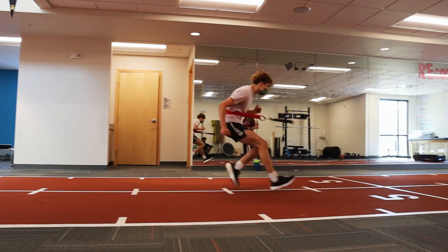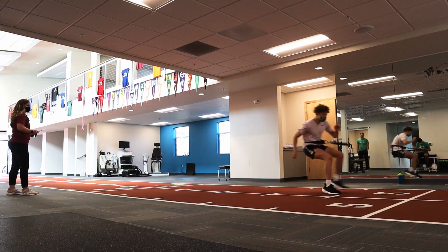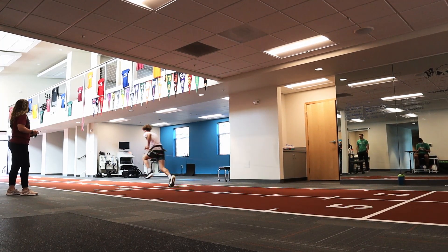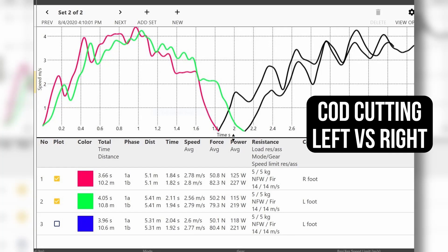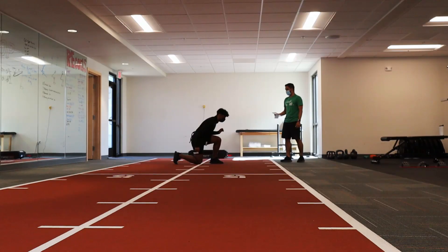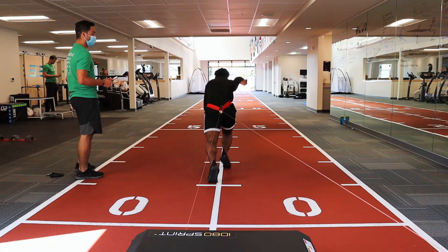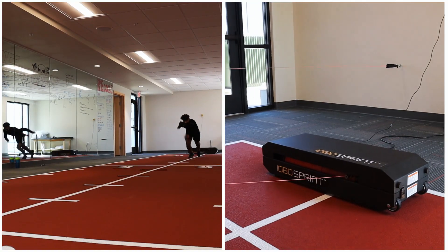Having them push off or plant with their affected side versus their unaffected side and looking at power production and the time that it takes for them to change direction — that's where the 1080 has been really helpful. If you're just doing that test you can time them and see how long it takes and get a good number, but how effectively are they moving and how quickly are they moving on one side versus the other? Using the equation that the 1080 gives us, we can find where it's most optimal for them to train for power.